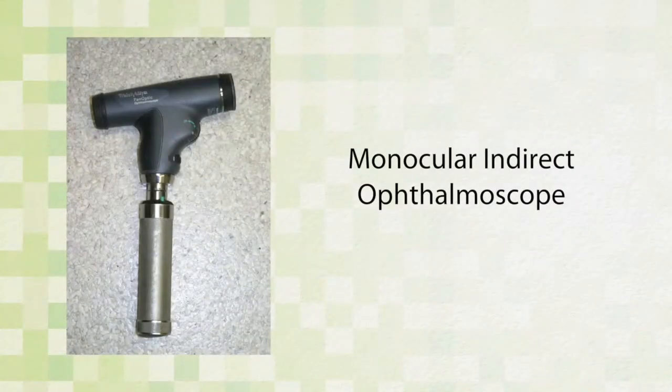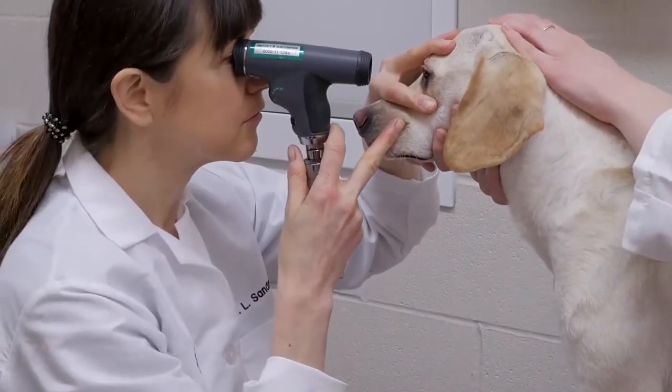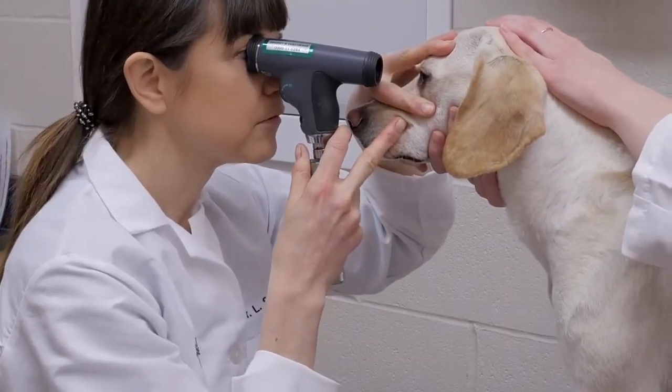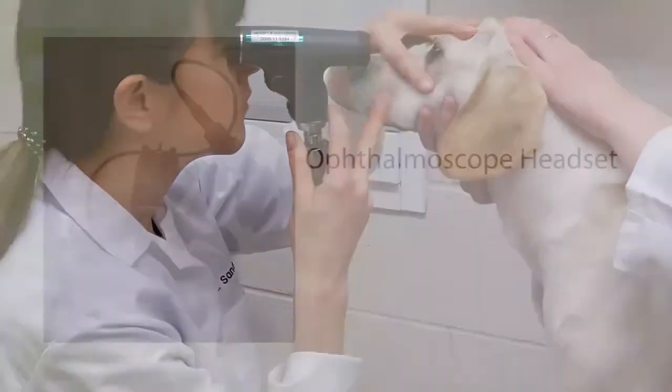Monocular indirect ophthalmoscopy can also be performed with a handheld ophthalmoscope versus a transilluminator. This special ophthalmoscope optically corrects the upside-down and reversed image for the examiner, allowing for a relatively easy fundic examination. The magnification provided is more than when the transilluminator is used, but less than that of the direct ophthalmoscope.